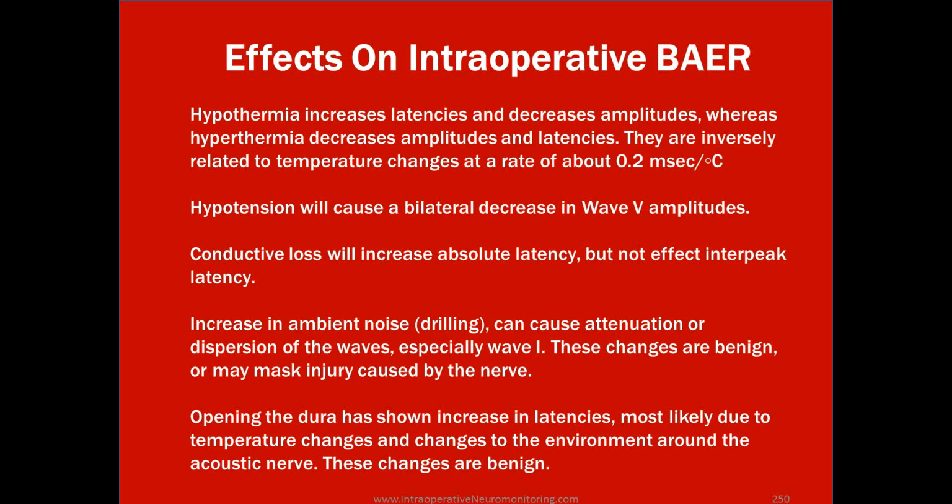So when you're doing these BAERs, they usually have to crack open the cranium, and they use a drill quite a bit. So during the time of drilling, ABR is pretty much unreliable. And even shortly after, it causes this transient deafness or loss of hearing, which usually resolves right after. Opening the dura has shown increase in latencies, most likely due to temperature changes and changes in the environment around the acoustic nerve. These changes are benign.